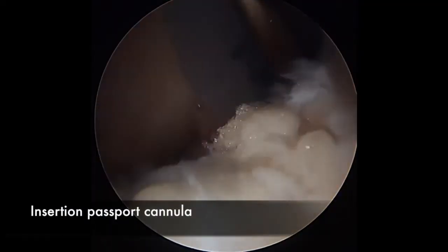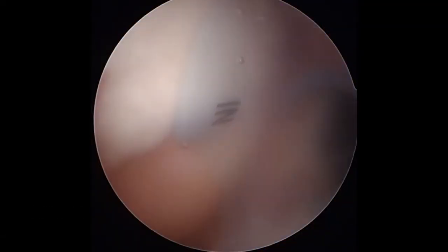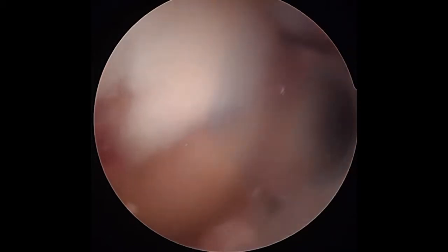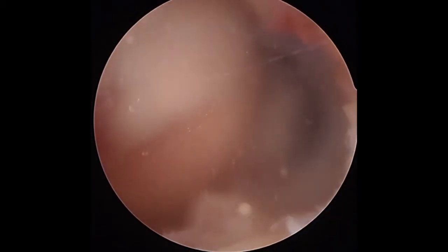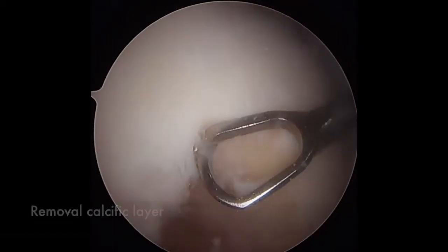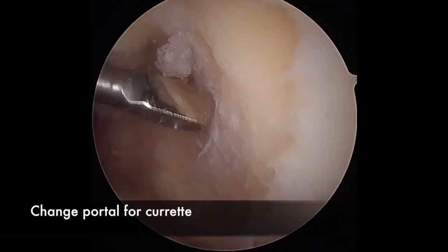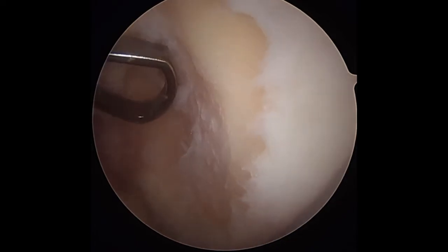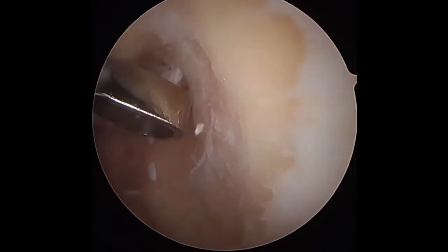A passport cannula is inserted into the medial portal to keep soft tissue away from the area and for drainage in preparation for CARGEL application. A curette is used to remove the calcific layer of subchondral bone, then switched to the lateral portal to achieve a better angle for removing the remaining portions of the calcific layer.